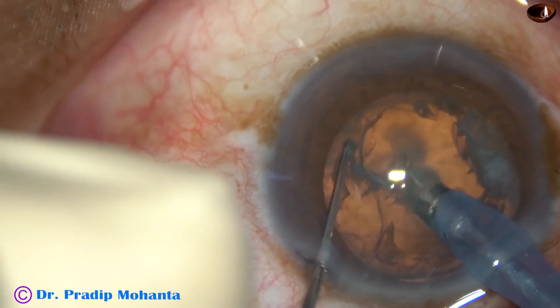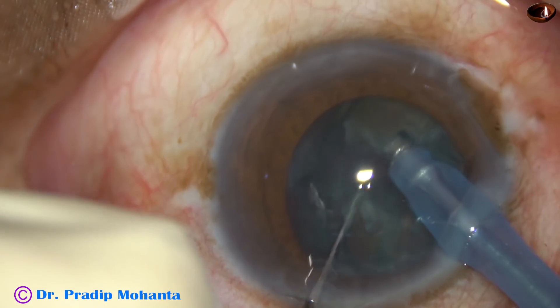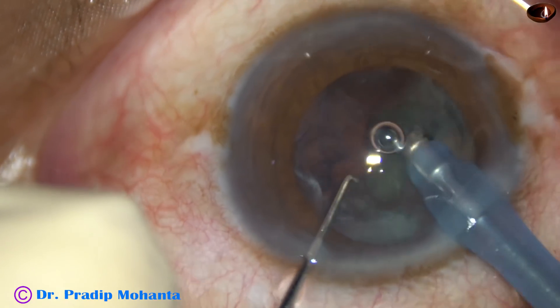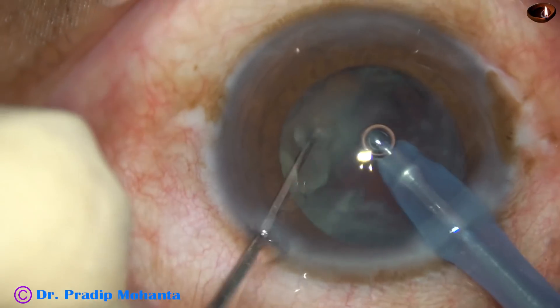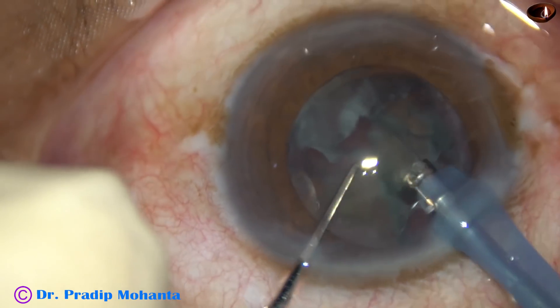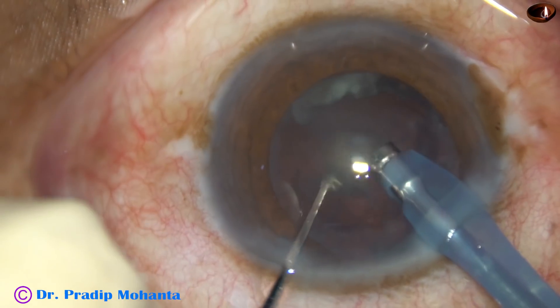Now the tip is buried into the substance of the nucleus and at the center it is placed in irrigation with vacuum, and the nucleus is sliced. Thus the nucleus is divided into several pieces, and then using only 20 to 30% ultrasonic energy, we can emulsify the pieces. The nucleus is managed.